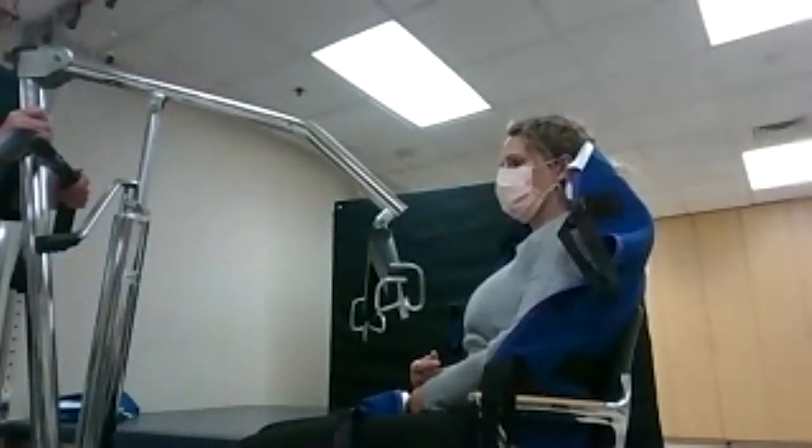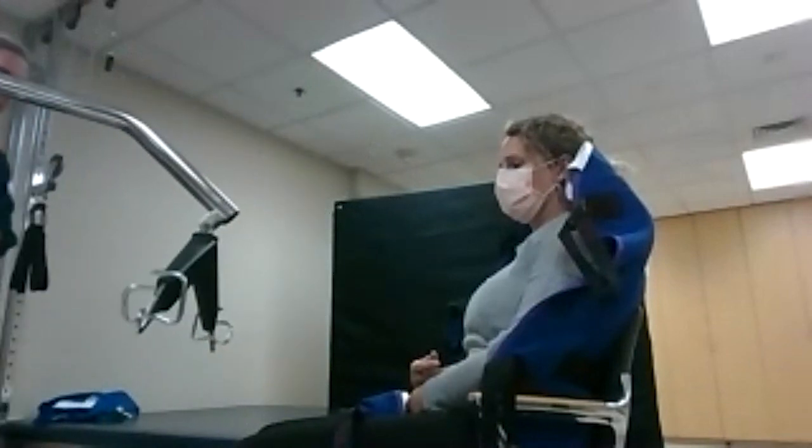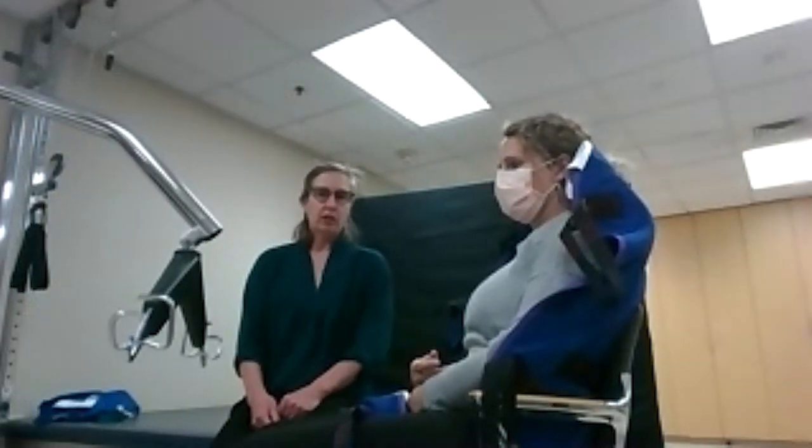The key idea is: do not take the patient through the house with the lift mechanism — put them into whatever device they need to roll in. This device is very difficult to roll over carpet or through bathrooms. But now she could be in a rolling shower chair, a power wheelchair, and she can go about her day.